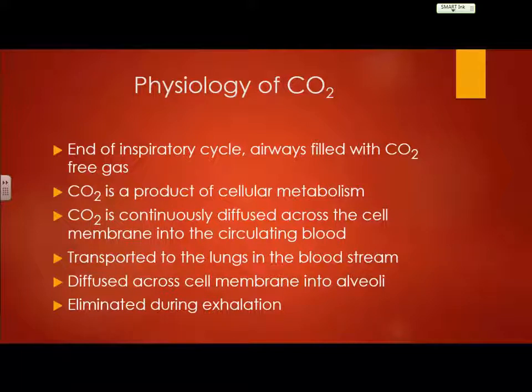Now think about the way that you breathe. My inspiratory time is a lot shorter than my expiratory time, right? As I'm breathing out, I have a rapid amount of air initially that comes out, and then I kind of plateau, all right? As I'm breathing out, the pressure stays about the same. And then, as that CO2 finally gets out of my system, if I'm measuring CO2 on a waveform and my CO2 starts to drop, what am I going to expect my waveform to do? Start to drop, right? And then, as I start to take my breath in, I'm going to see it rapidly decrease and then go back to that baseline, okay?